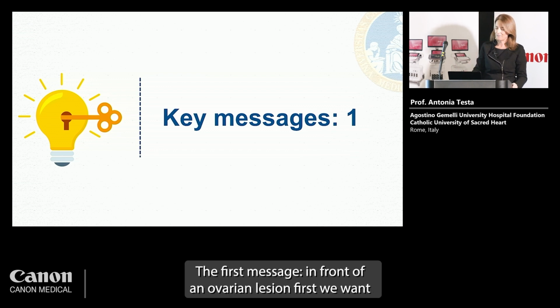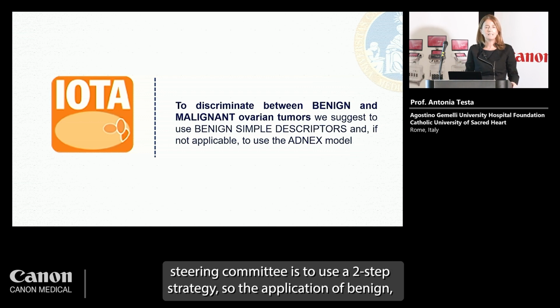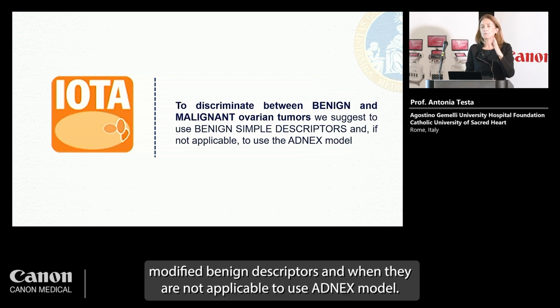Ready? The first message: in front of an ovarian lesion, first we want to know, is it benign or malignant? And the suggestion today from the IOTA Steering Committee is to use a 2-step strategy. So the application of benign, modified benign descriptors, and when they are not applicable, to use the Adnex model.